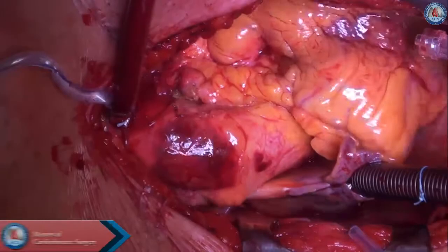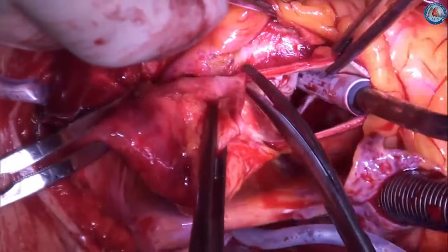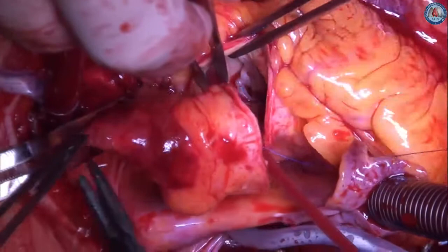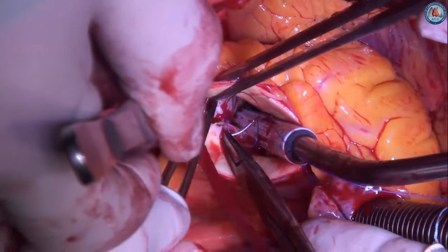After cross-clamping, the aorta is transected transversely 5 to 10 mm above the sinotubular junction. Subsequently, blood cardioplegia is given directly into the coronary ostia. Stay sutures are placed through the commissures and fixed to the patient's chest wall.